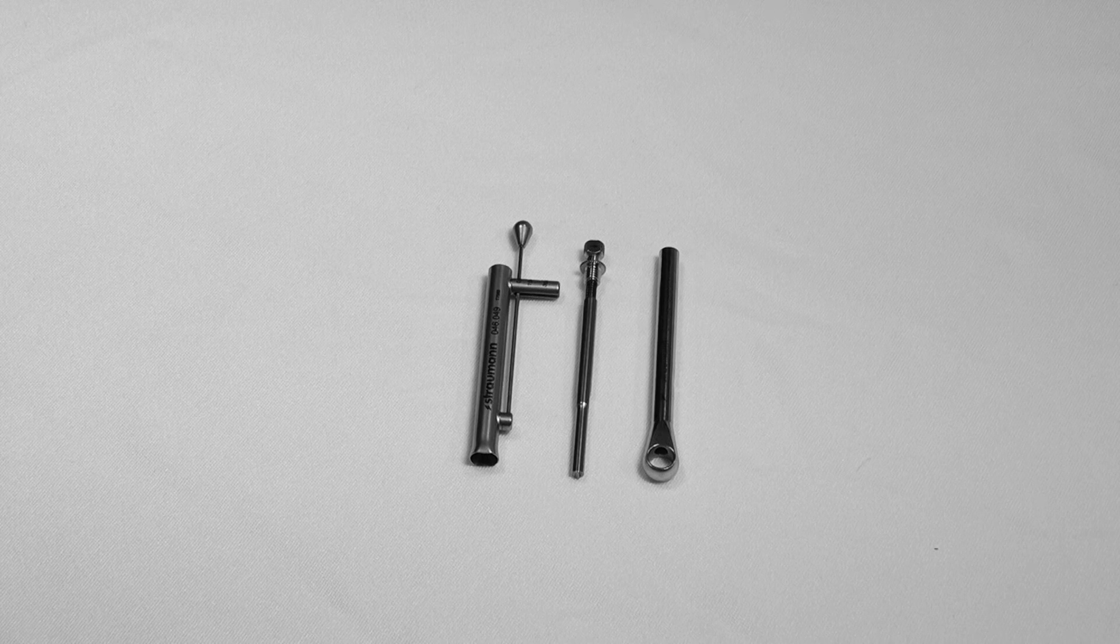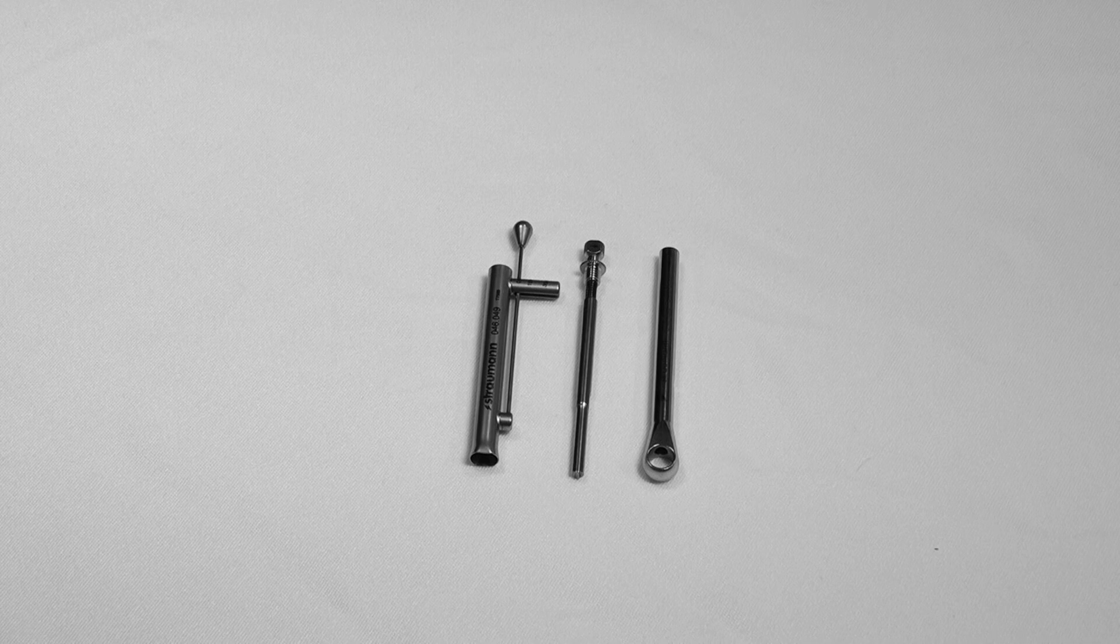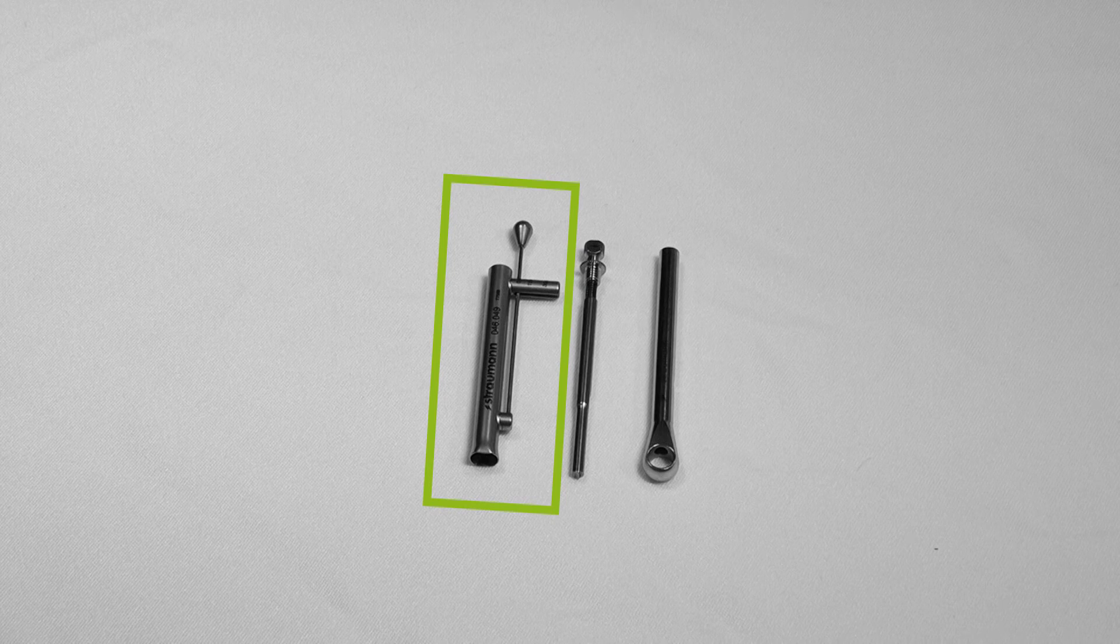The Strommen Torque Wrench is a precision instrument that is comprised of three separate components. These are the ratchet body, ratchet bolt, and the torque control device.